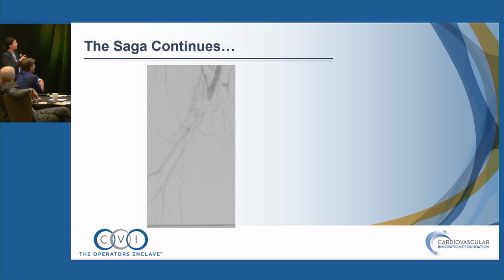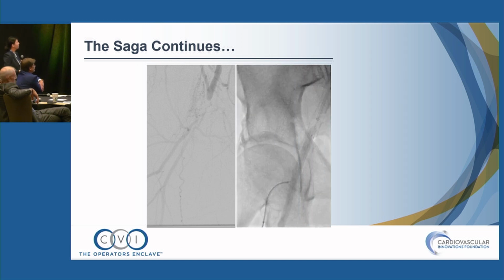So we took him back, same picture. This time, I was able to cross relatively easily from antegrade. I spent more time trying to get through that profunda to really have that backup system in the event something does go down. I even tried something called ECART, which is electrocautery, with a stiff wire, trying to poke into the common femoral, and I just couldn't, even using a balloon on the other side to make a hard surface for me to push against.